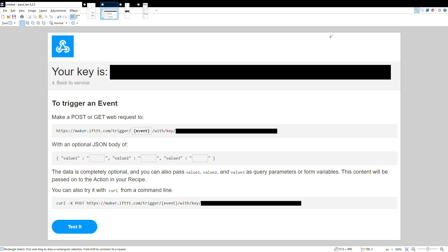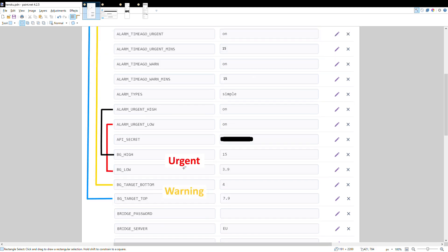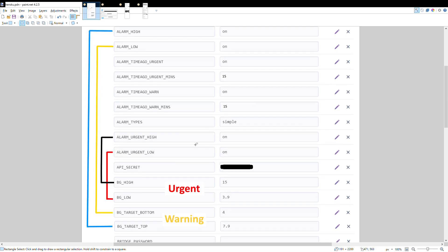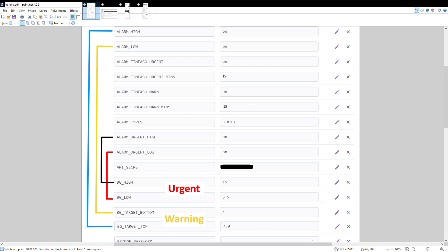I'm using another screenshot from the Heroku dashboard because I don't want to show my personal keys. The webhook maker key is the one you've copied, and it goes into the maker key field for these events to work. Some of these settings aren't very clear, so I'll explain them: the target bottom and target top are your blood sugar target ranges — essentially the warning ranges. When it goes above or below these numbers, you get a warning high or warning low. You may want to change these numbers to suit your healthy range.